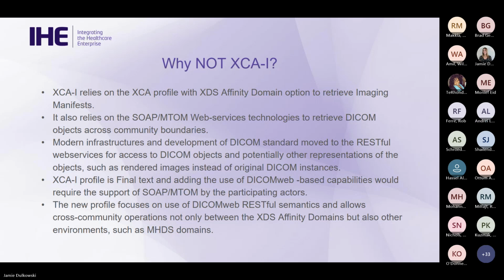It also relies on the older technologies such as SOAP and web services to retrieve the DICOM objects across community boundaries. Modern infrastructures and development of DICOM standard in the recent years in actual practice strongly call for the RESTful web services to be used for access of DICOM objects, and also allows for accessing other representations of the objects, for example, rendered images instead of original DICOM instances, which makes a lot of value when you have to retrieve information only for the reference purposes, and that retrieval has to cross multiple boundaries and cross multiple communities.